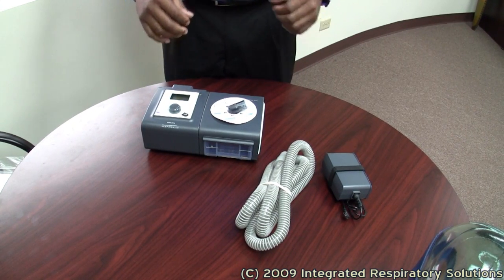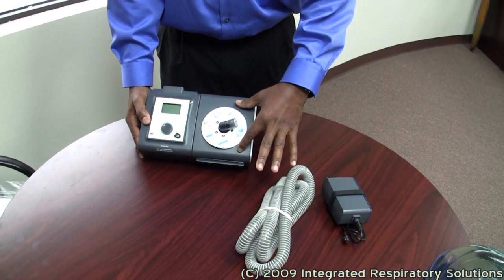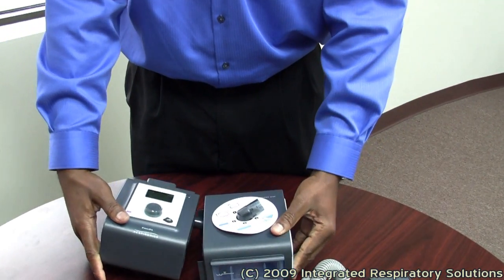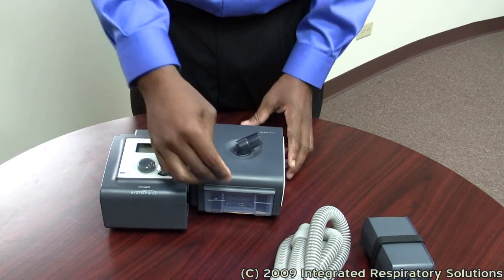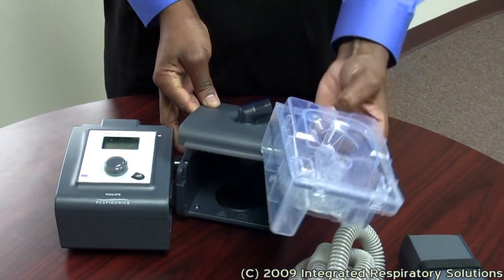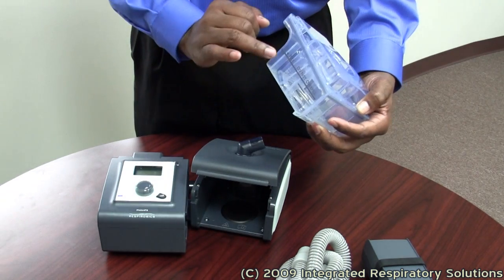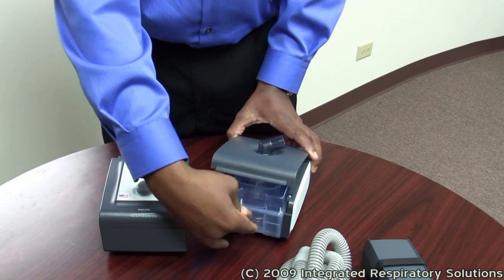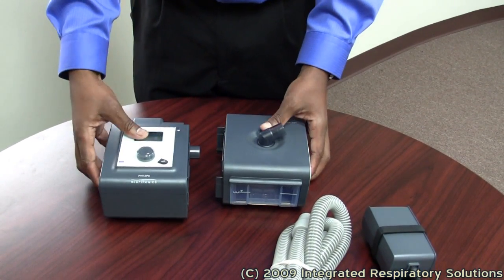Your CPAP BiPAP device is often delivered with a humidifier attached to it. This is the humidifier portion of the device. There is a release latch at the bottom of this piece that you pull out and they separate. There is also a humidifier chamber tucked away here — this piece slides right out. This is the chamber that you will fill with distilled water up to the fill line. This will prevent dryness while you sleep. Let's reinsert this piece back in. The chamber only goes in one way, so you cannot insert it wrong. Let's integrate these two back together.